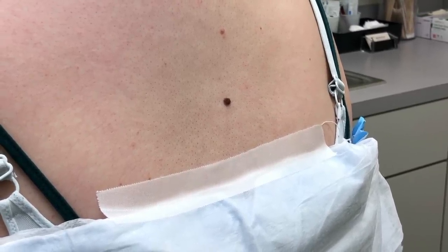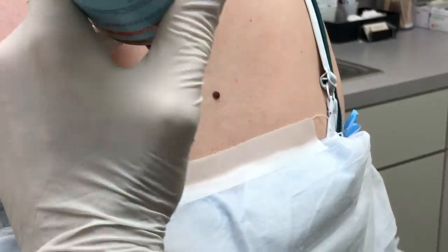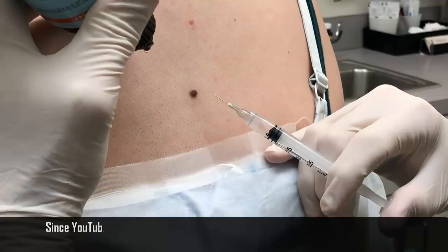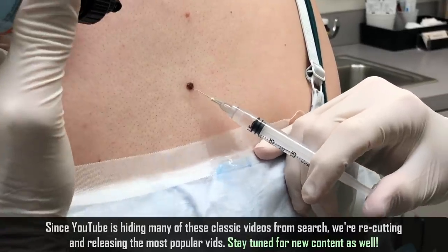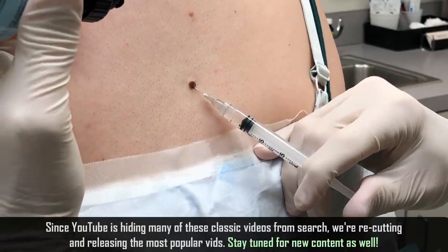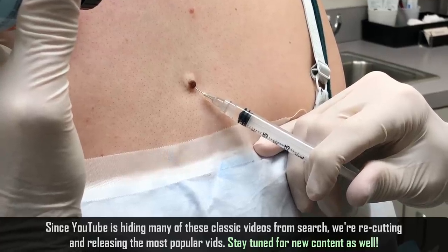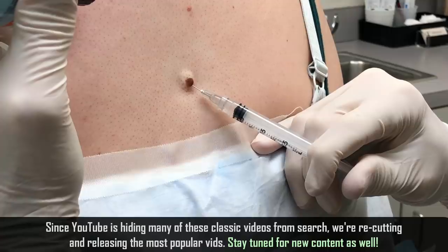Are you okay if we video your procedure for our friends on YouTube and Facebook? Yes. This is gonna feel a little bit cold. Are you ready? Yes. Cold. What you gonna feel, Gumby Jean? Stick's gonna burn. Here it comes. A little stick. Sting. You feeling the sting and a burn? Good. Nice and slow. We'll take it slow.